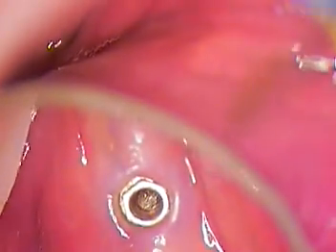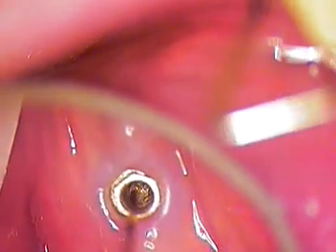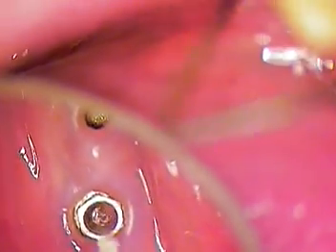I have a periodontal probe. So there is movement in the first screw — we noticed that right away, so that's good news. Now the key is to keep the threads going so that we can back it out of there.